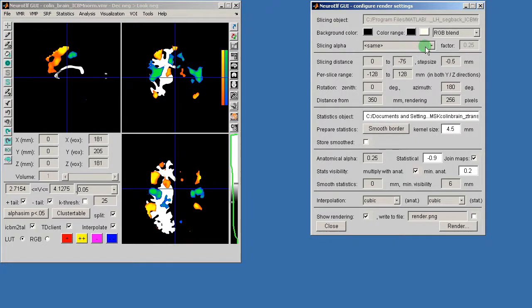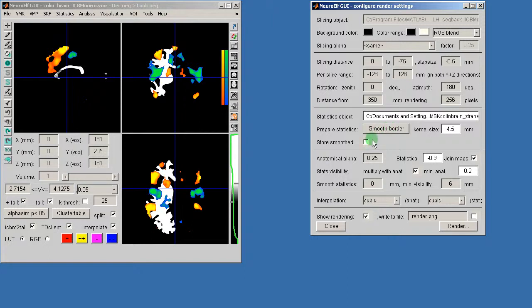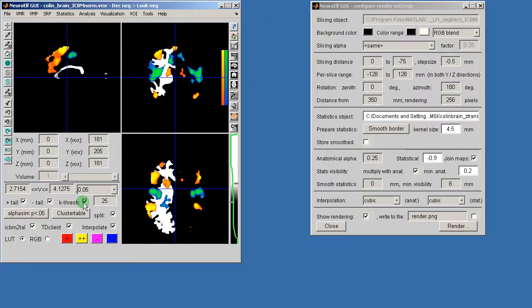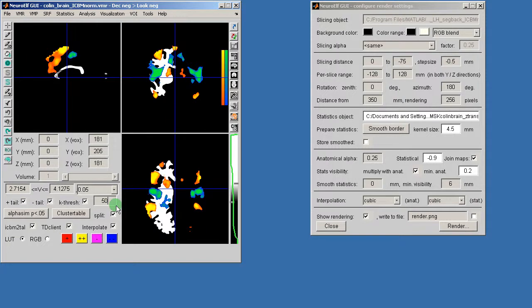Which I will do so that at the very edge I won't have any problems with very pixely edges. I'll try to match roughly the cluster size thresholds and then I'll smooth the border.